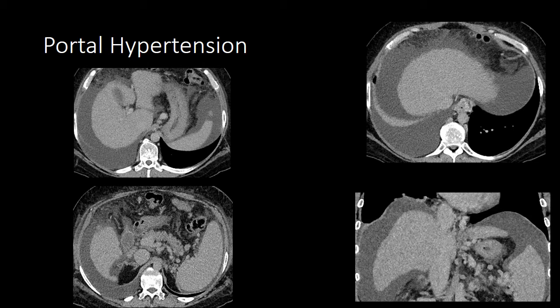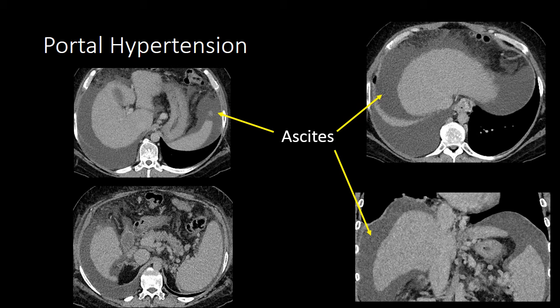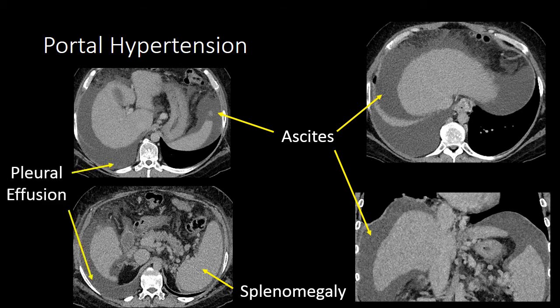Patients with cirrhosis often develop portal hypertension, which can manifest in a number of different ways. On imaging, we look for ascites, or free fluid within the peritoneal cavity. We also look for the presence of an enlarged spleen, commonly referred to as splenomegaly. Some patients will also develop a right pleural effusion related to their portal hypertension.